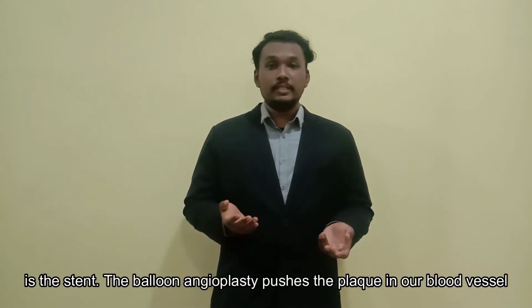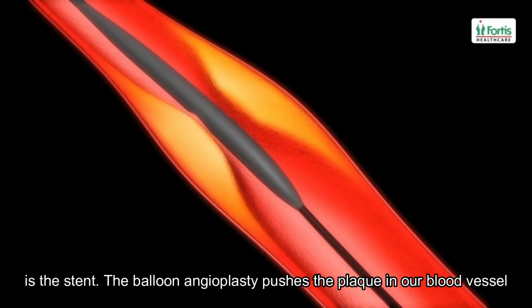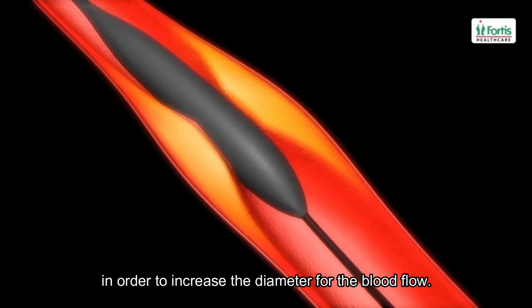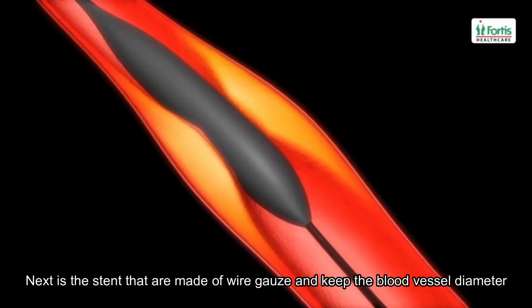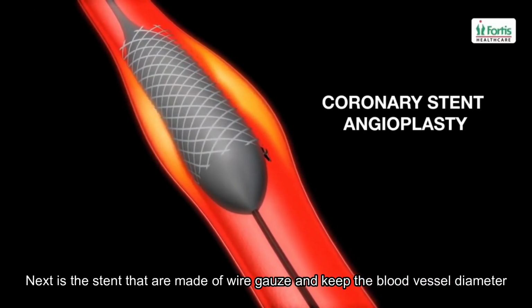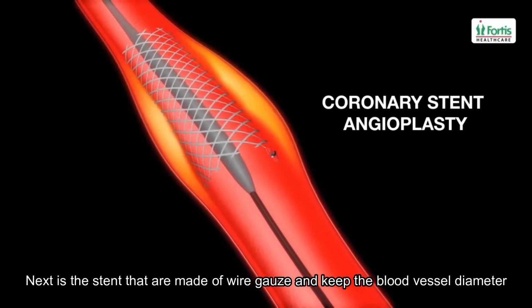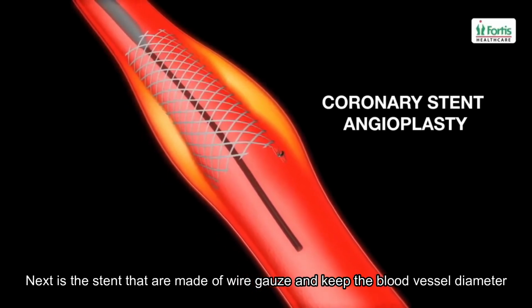The balloon angioplasty pushes the plaque in our blood vessels in order to make room or to increase the diameter for the blood flow. Next is the stent, which is going to be inserted. They are made of wire gauze. They are inserted and they keep our blood vessels' diameter.